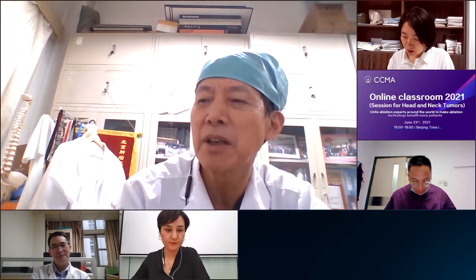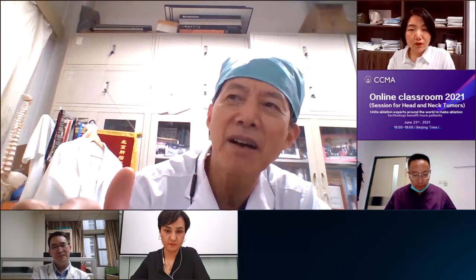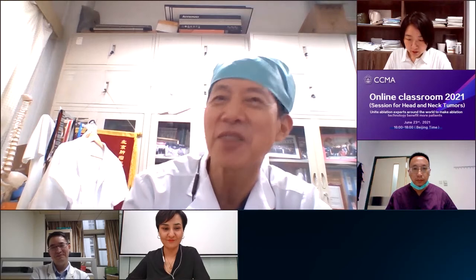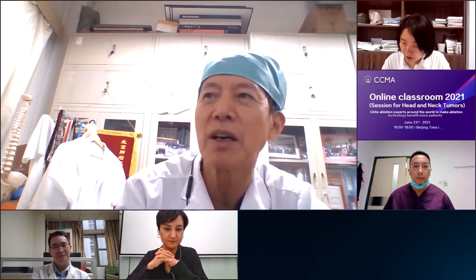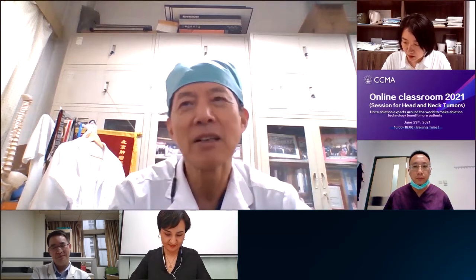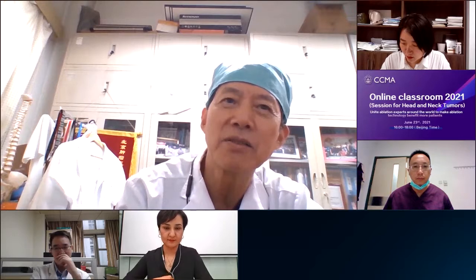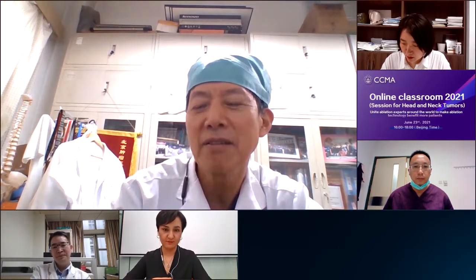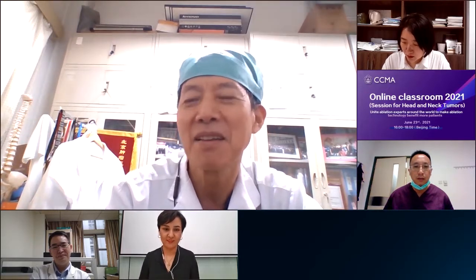Dr. Long said he used a hardening agent injection, and then it is easier to ablate, and the result of ablation is much better, right? Dr. Tang, yeah. Also, I think this is a very good experience for how to treat cystic thyroid nodules. 囊性滤泡性，我们也就叫囊性或滤泡性的甲状腺结节，所以这是一个经验。Okay, this is also a very valuable experience. Thank you.